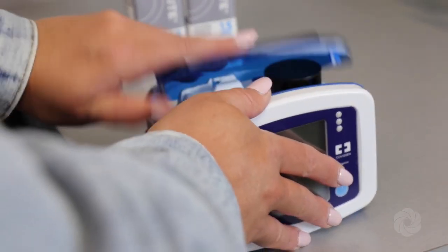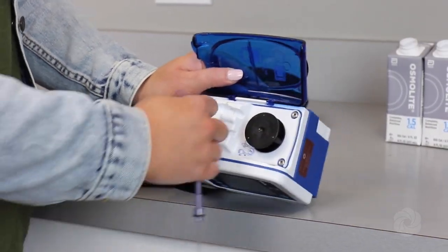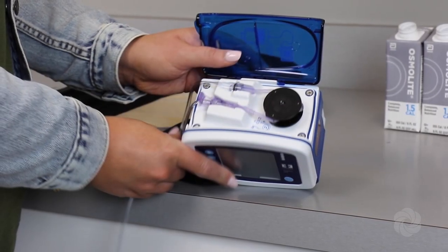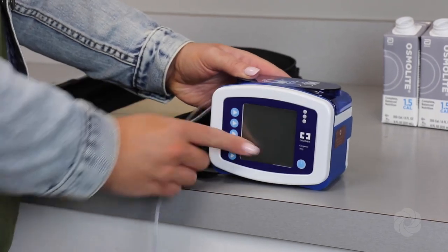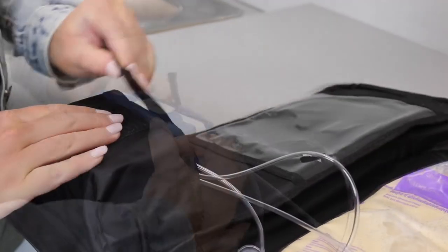Open the blue door on the pump. Locate the clear tab on the tubing and set it into the pump facing upwards. Wrap the tubing around the pump wheel per the diagram under the door of the pump. Ensure that the tubing exits the side of the pump and then close the blue door. Place the pump in the front pocket of the backpack and secure it into place. Thread the tubing out of the backpack and zip it closed.